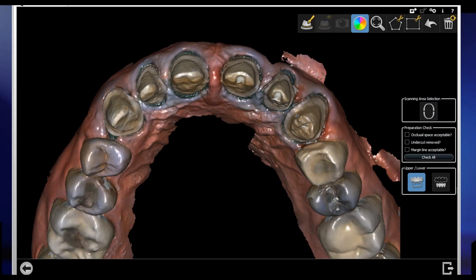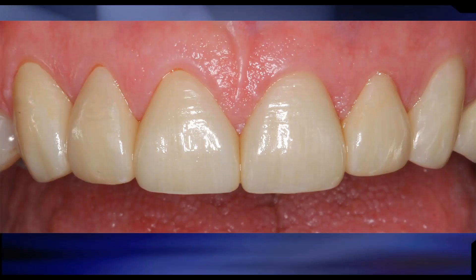Here's a situation where we did six anterior teeth. One of the nice things about this technology is if you miss a margin on one tooth, you don't have to take a whole new impression — you can just cut out one section and rescan just that part of the margin. Sometimes on multiple teeth we'll scan one tooth at a time, packing cord as we go across, which helps greatly with tissue management. Here's the final result — zirconia crowns for this particular patient who was a bruxer. They're very strong, and the marginal fit and aesthetics are actually quite good.